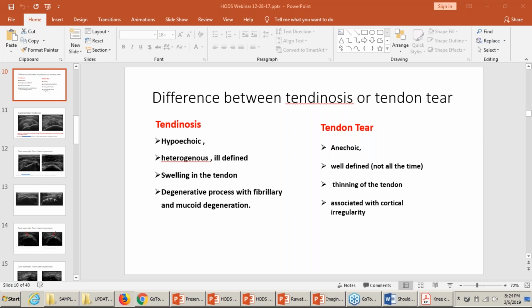Okay. And Mohini, when you rescan, would you just scan the affected area, and then it would be a limited, not a complete scan again? Follow-up exam is usually a limited exam. Yeah, right, limited exam.